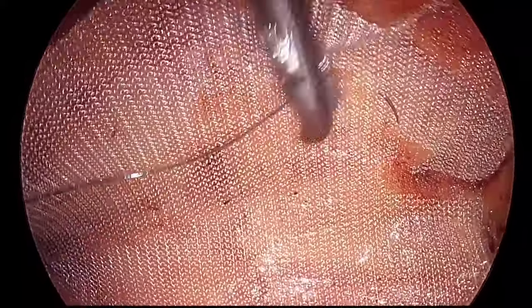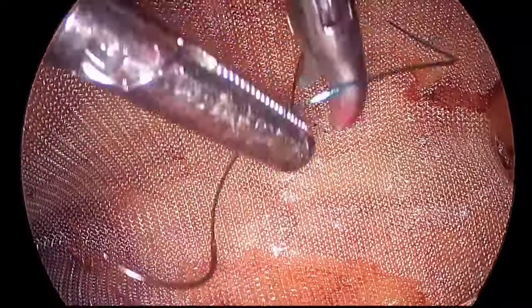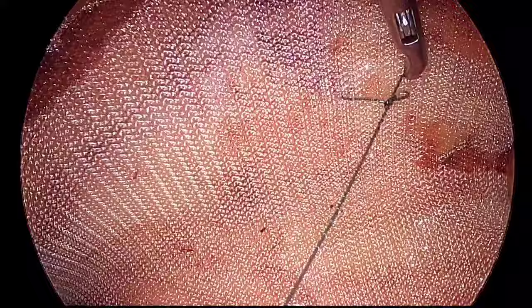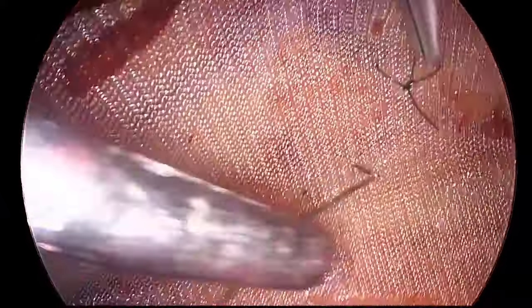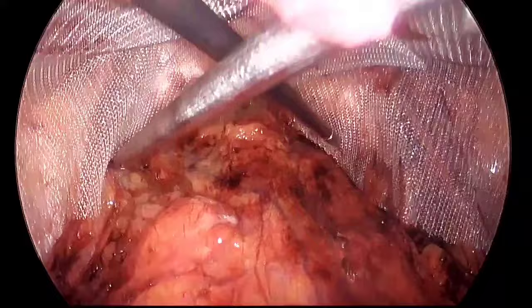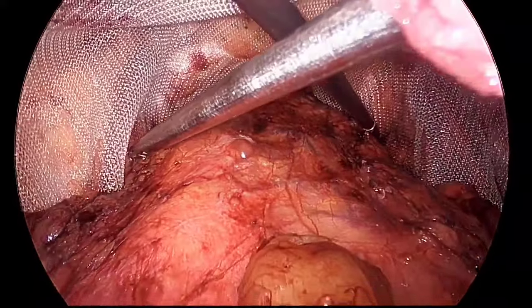And there is another fixation for the right sided mesh, the bigger mesh for the bigger hernia that I have placed. The upper outer corner of the mesh was fixed with the lateral abdominal wall muscles, and that should not be too tight. It's known as a floating stitch, or anchoring stitch, so that it will keep the mesh at this position. So now the mesh fixation is done, the hemostasis is checked, and gradually deflate the pneumoperitoneum. The patient was absolutely fine in the postoperative period, mobilized within 4 hours, so walking around, and discharged on the postoperative day 1. Thank you.